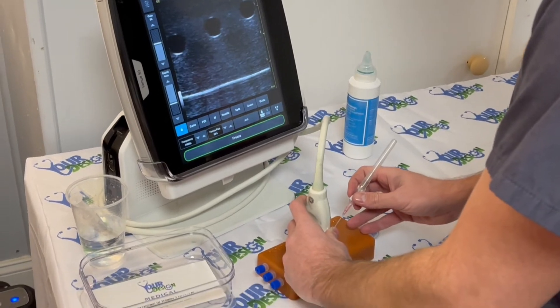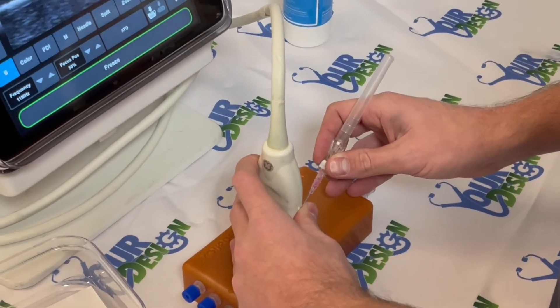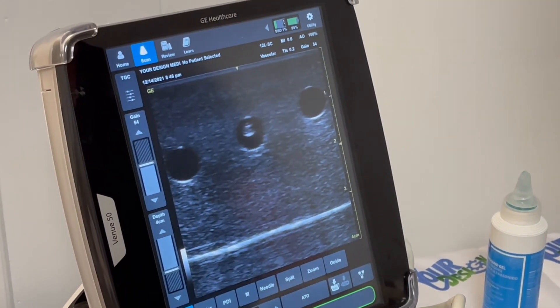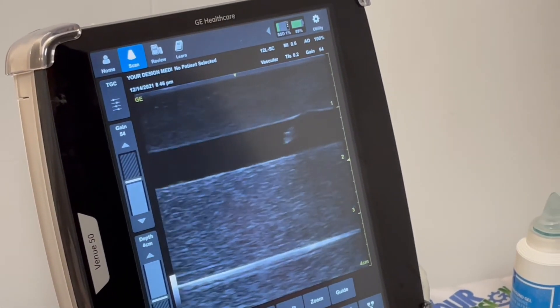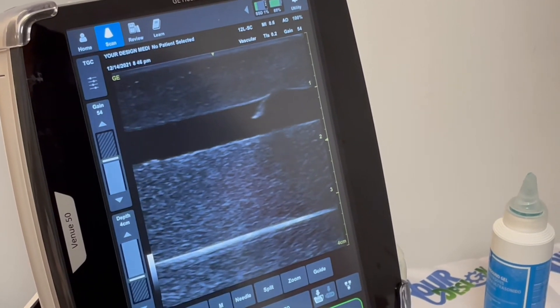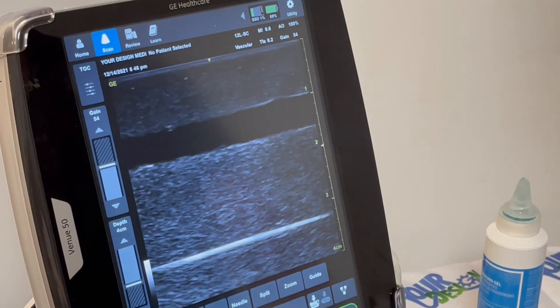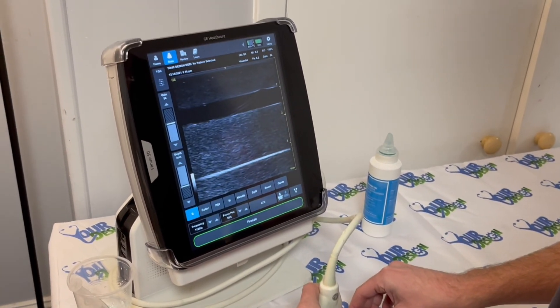Use needles of any type, including angiocatheters or straight needles. The needle visibility is clear in both short and long axis. You can confirm placement and visualize the catheter by ultrasound with a clear, crisp image.